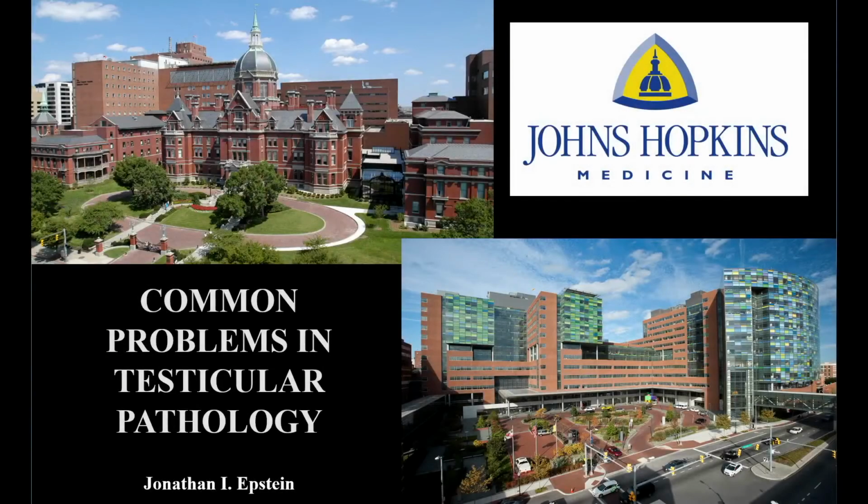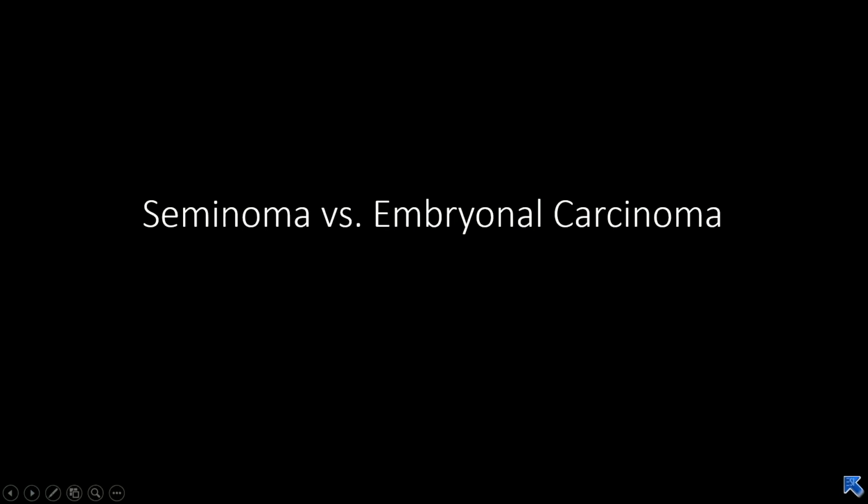So the first talk is going to be common problems in testicular pathology. So first, very simply, two common tumors, seminoma and embryonal carcinomas. Important to distinguish between the two because there are different therapies with each one of these.